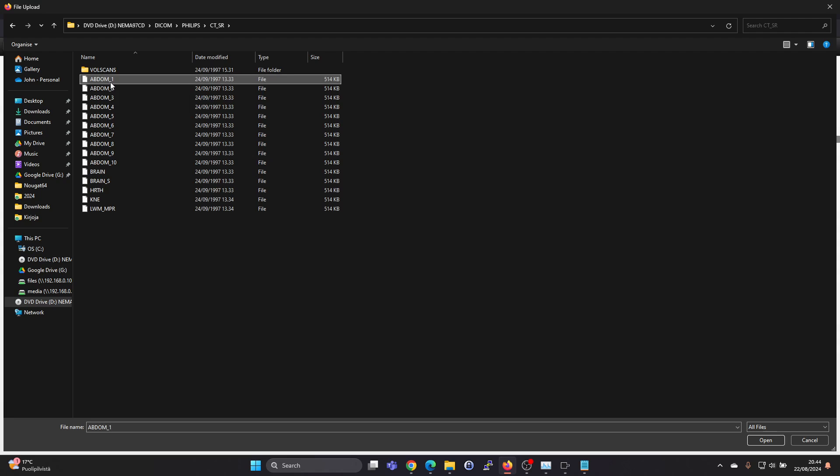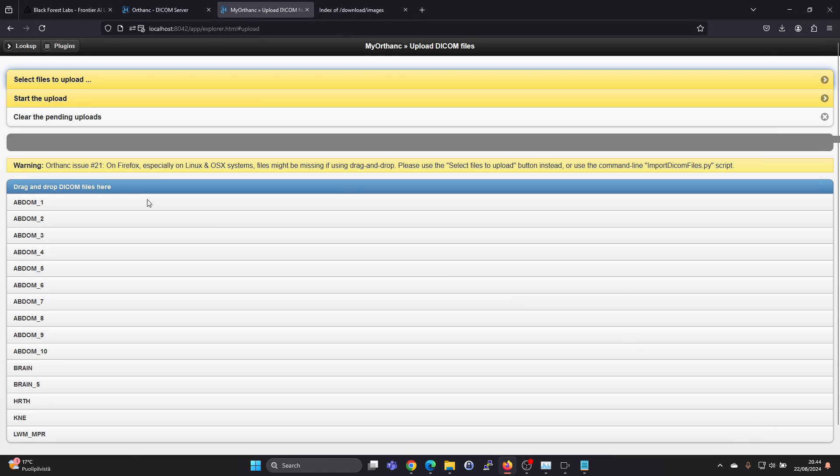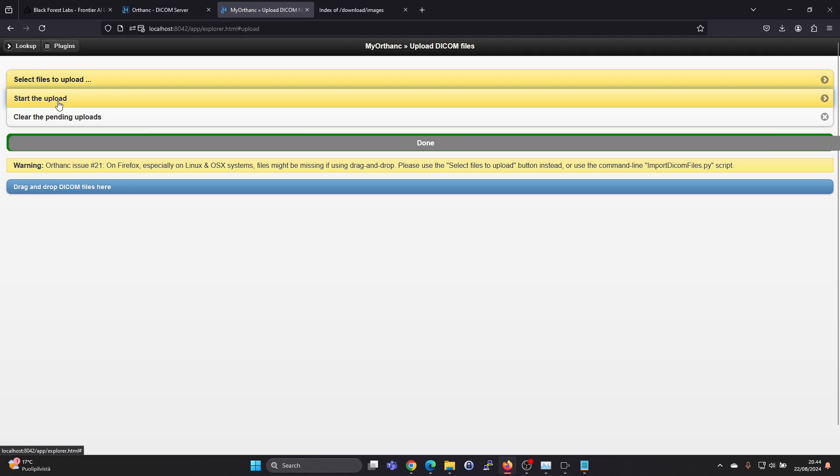And select some images. Here's a CT. And let's select all of these files. Press open.